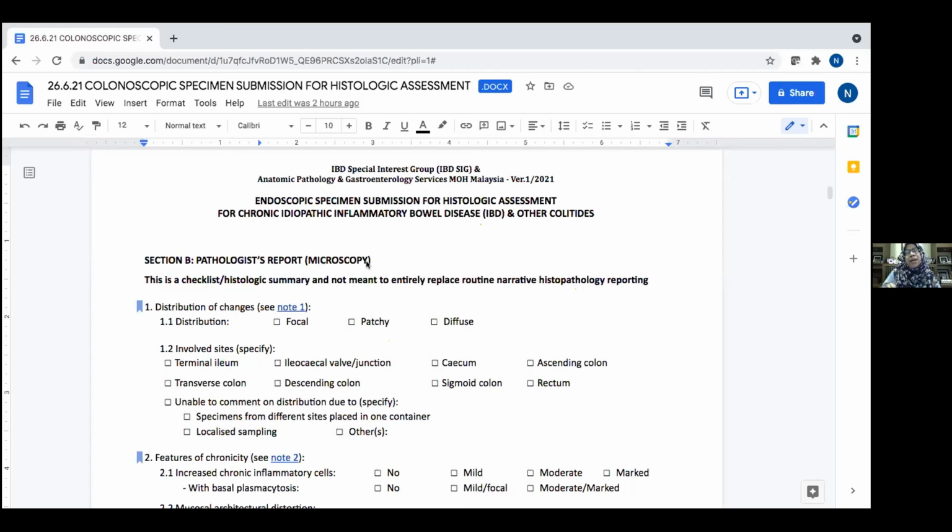Microgranuloma in the subepithelial or superficial mucosa is something which should make you think of Crohn's disease first. Of course, in drug-induced colitis, a granulomatous pattern is possible, but drug-induced pathology is always by exclusion.